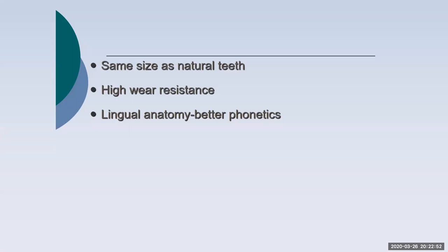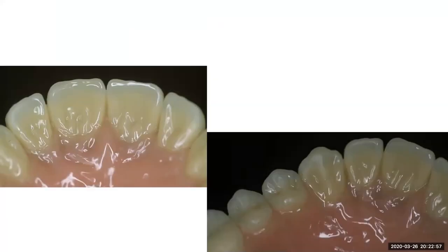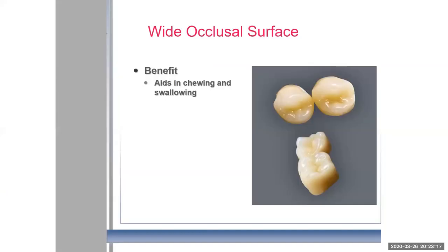And I like lingual anatomy on the anterior for better phonetics. I'll show you why. If you look at these anterior teeth on the lingual, you see this lingual anatomy, and we have a rugae in the palate. Many denture wearers have a problem with lisping and their tongue sliding off the lingual of the teeth. So when they're wearing that new denture, it's a problem. This helps eliminate that problem. And of course, we want a wide occlusal surface that aids in chewing and swallowing.